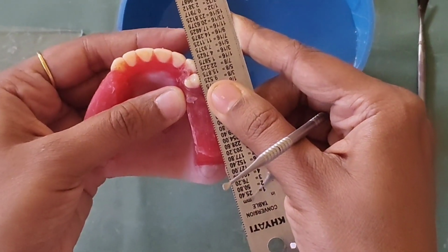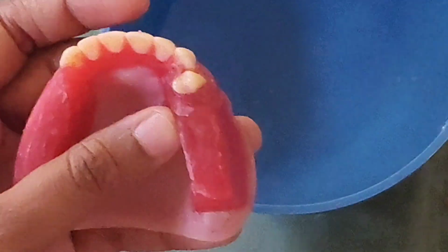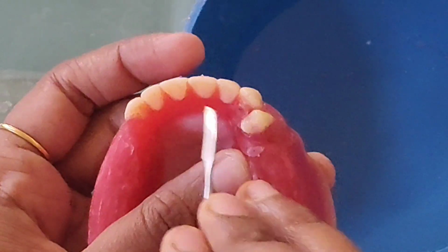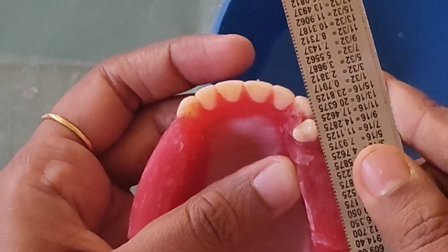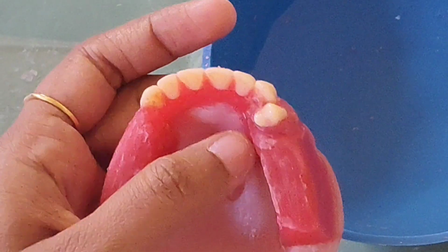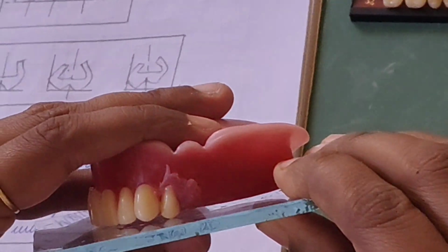See the canine, this half is with the anterior, this half is with the posterior. So when I arrange the posterior part, it should come in this line. Then the glass plate, I will give in your hand one by one. You can see.